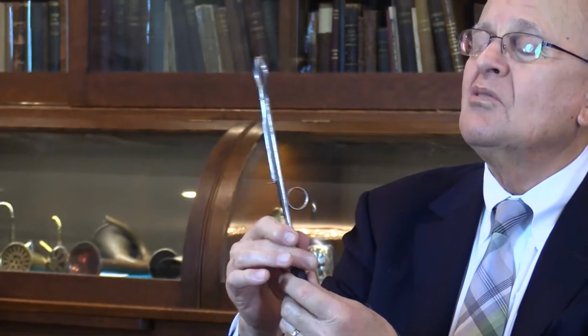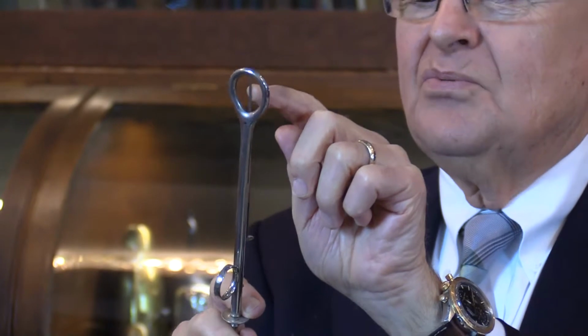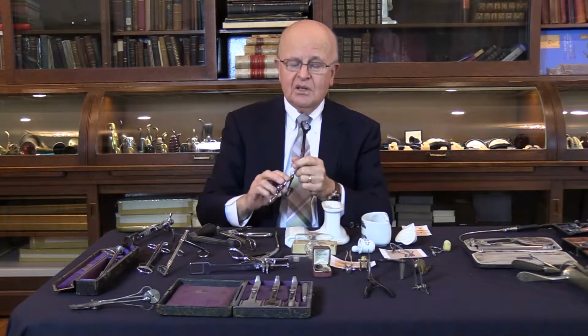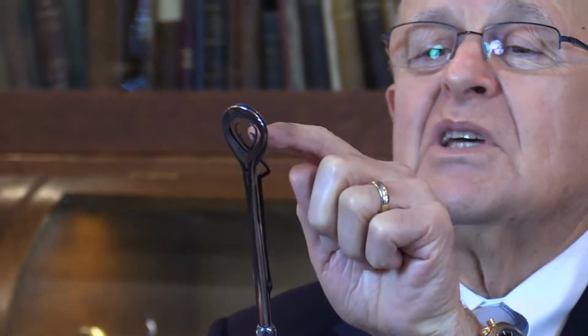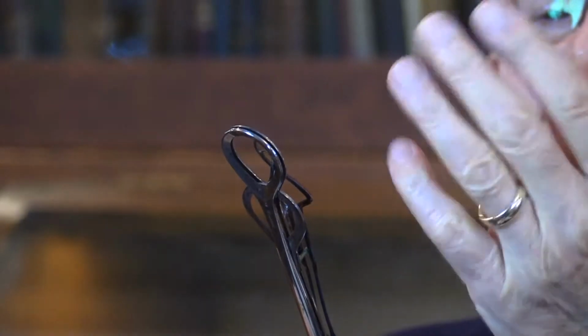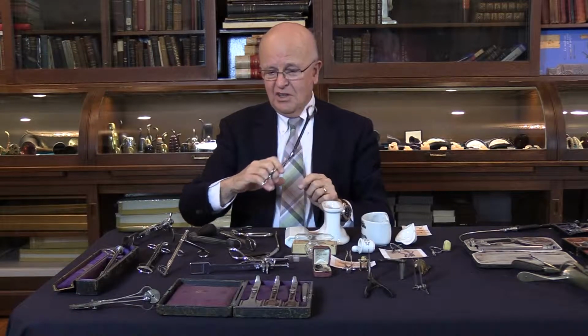This is an older type, and it has one fork here to hold the tonsil. Another very interesting one is this guillotine. So here is the opening. The tonsil goes through this opening, and the first thing that happens when you press here is that this comes out and holds the tonsil in place, and you keep squeezing the handle. It cuts the tonsil out, and you remove it with the tonsil still hooked to this area here.